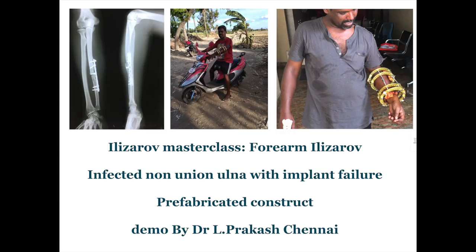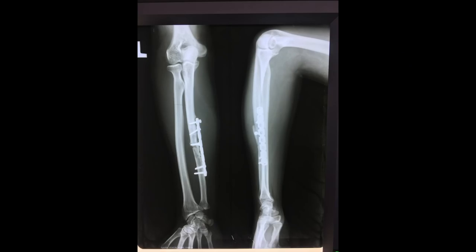This is a demonstration of a four-ring prefabricated Ilizarov construct for an infected non-union of the forearm with an implant failure.